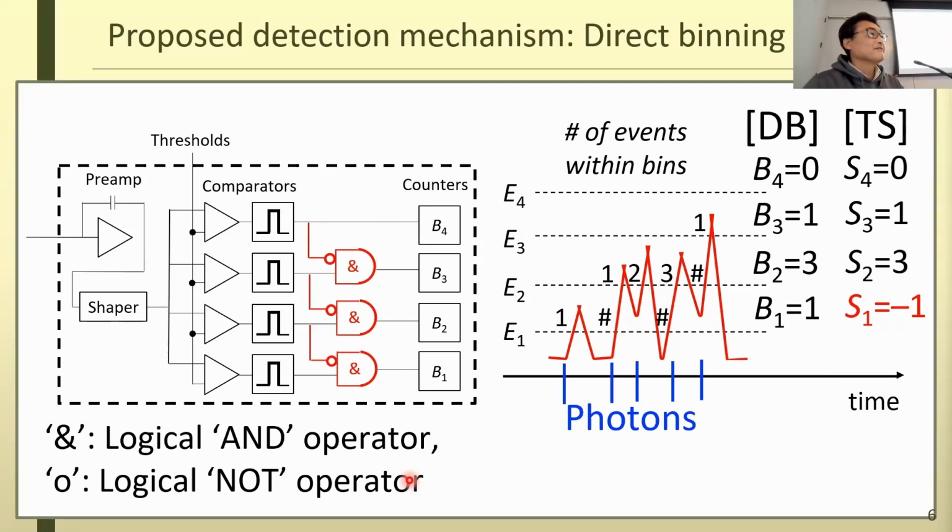Just to follow up, when you have those pound signals for the lower energy bins, how wide of a time window do you leave that open? Good question. In this experiment, we used half of the pulse duration as a coincidence time window, which is 10 nanoseconds. It could be shorter because we are only seeing a part of this rising peak. It could be as short as 5 nanoseconds or so.